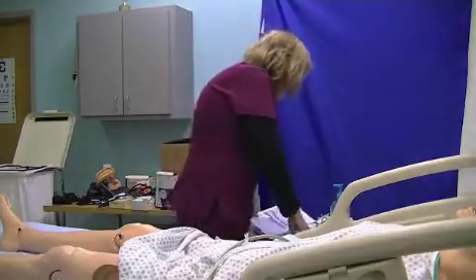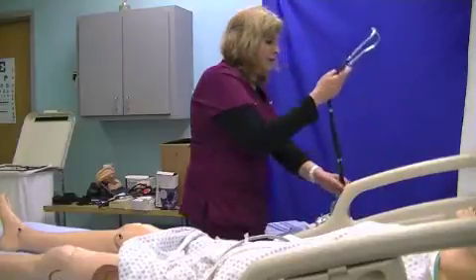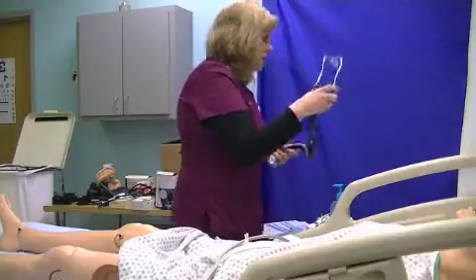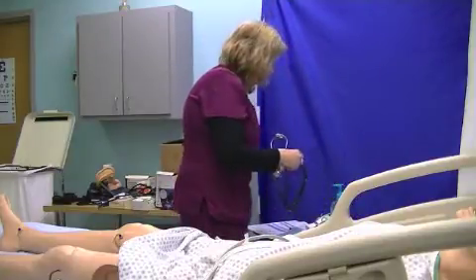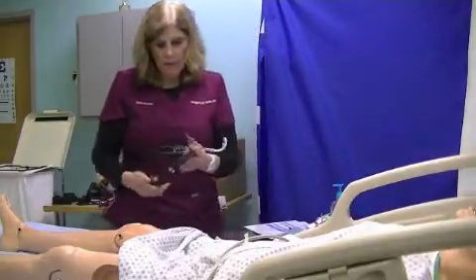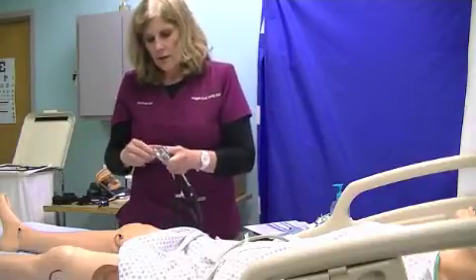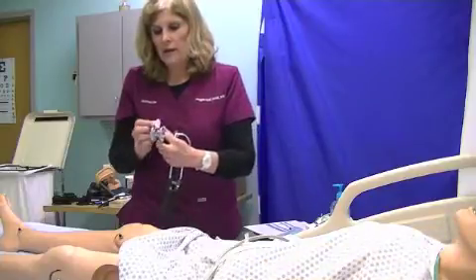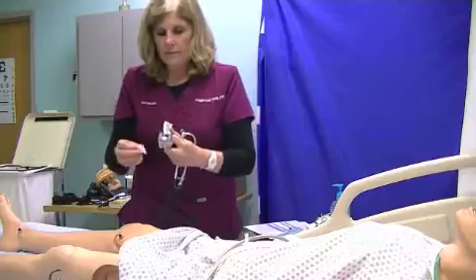Okay, let's assess the apical pulse now. So when I'm assessing the apical pulse, I'm going to use what is called a stethoscope. Now, with the stethoscope, you're going to have to make sure you clean it, because you don't want to transfer infections, so you should warm it up and make sure you clean it for your patients. Some nurses go from one patient to the next, and that transmits infection. You don't want to do that. So you go from one to another.